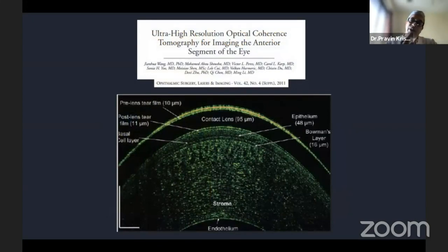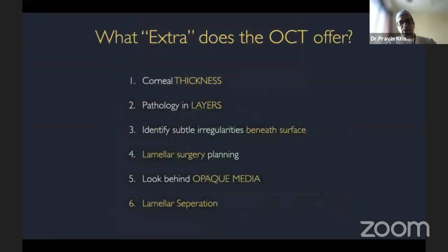There also are several OCTs available in research labs around the world called ultra high resolution OCTs that can actually give you better resolution than what you can get in the clinic. As of now, these are obviously not cleared by several regulatory agencies because of concerns with the amount of radiation that they will emanate. And so they're used mainly for research and they're not used for clinical use.